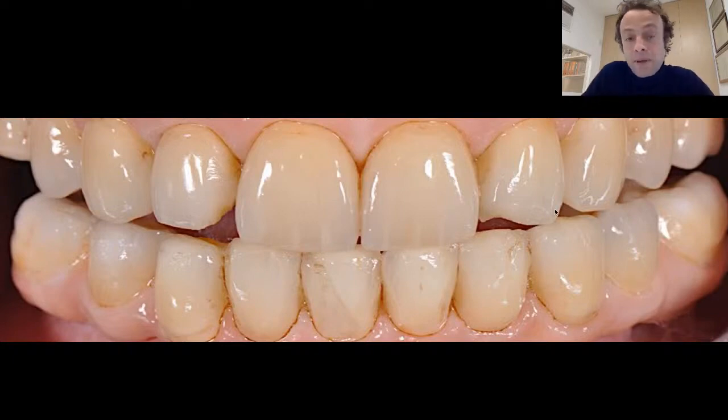This chipping can be repaired with composite, but we know that if we use bonding procedures on porcelain fused to metal or porcelain fused to zirconia, unfortunately this kind of procedure is not so reliable, because it's not easy to achieve a wonderful adhesion between this structure and our composite.